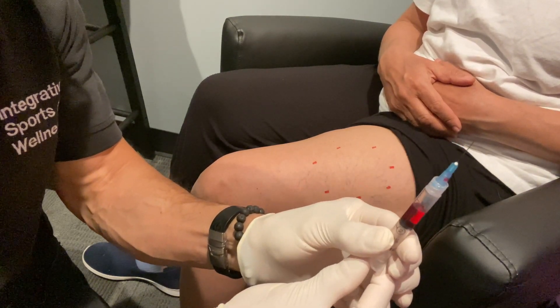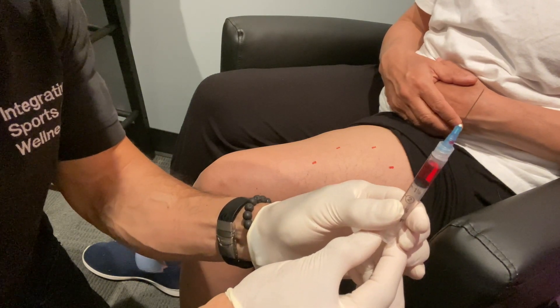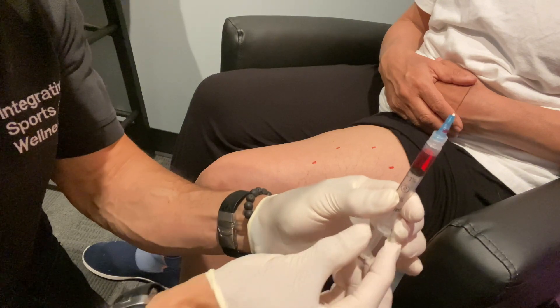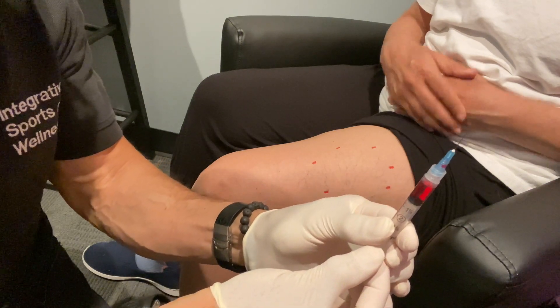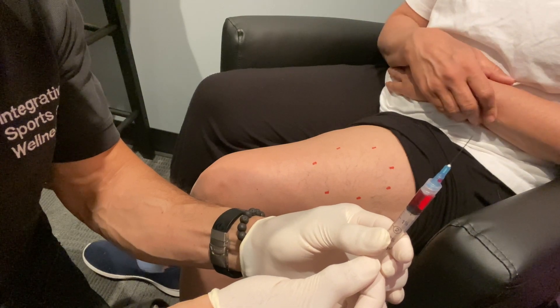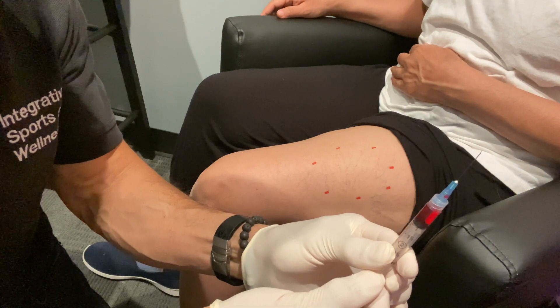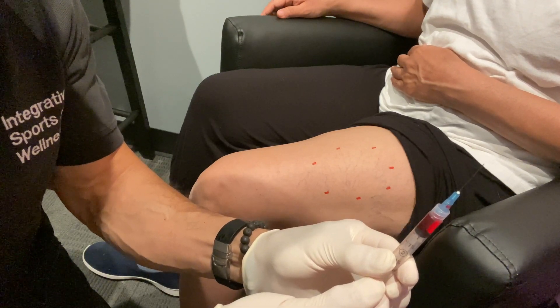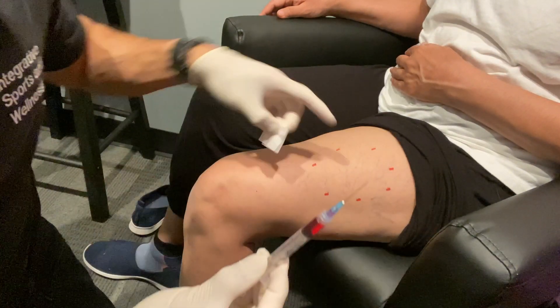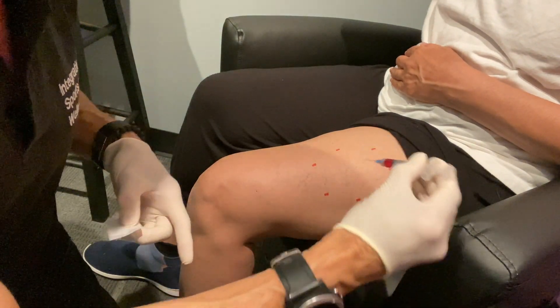Then we will have to waste a little bit to make sure we get all the air out. I'm pushing the plunger up and you'll probably see a little bit come out the tip of the needle — it's okay, we're not wasting it, it just gets all the air out. Injecting a tiny bit of air into the muscle is not painful, but it leaves a big bump. So we know where we're going.